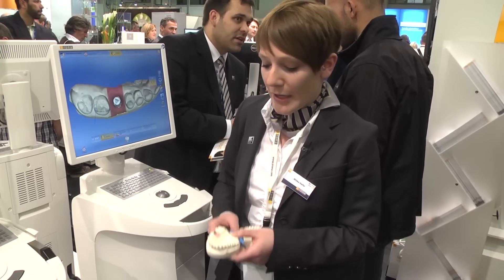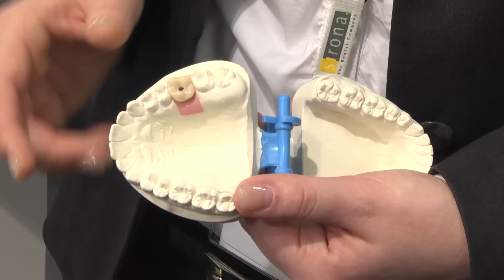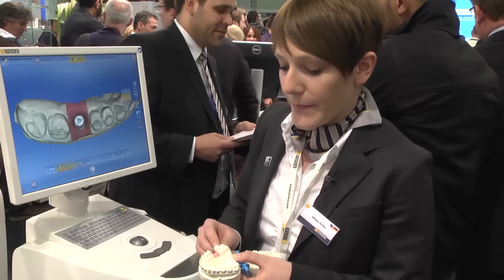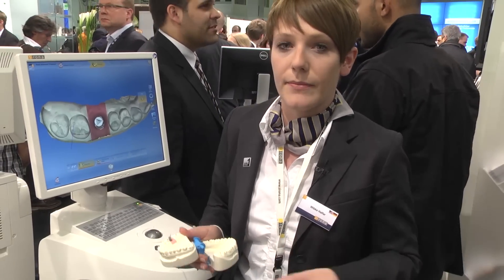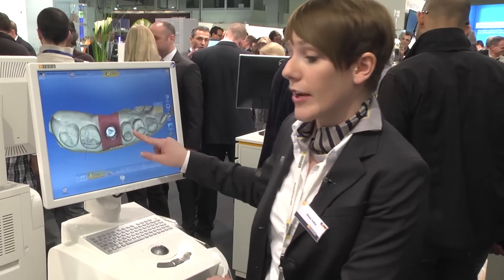Now I'd like to show you another advantage of the new CEREC software 4.2 — the intraoral scan of an implant. For this we need a so-called scan post. You make your intraoral images and can directly recreate a chair-side abutment and a crown. After scanning with the OmniCam it will be colored — this is a BlueCam case shown here.